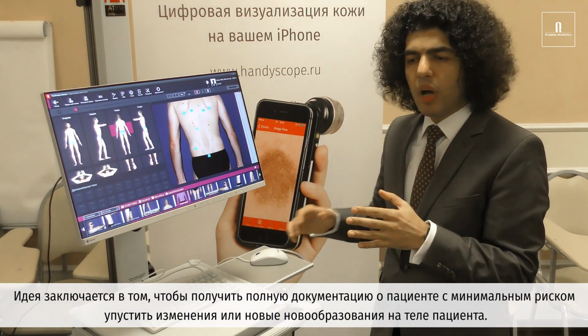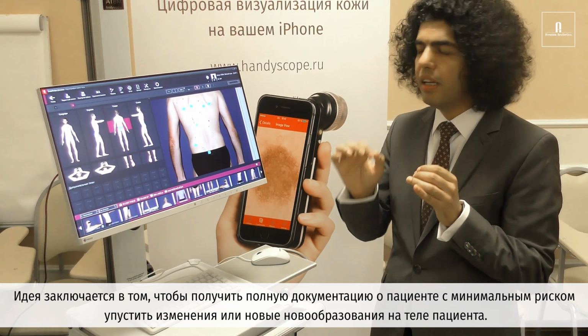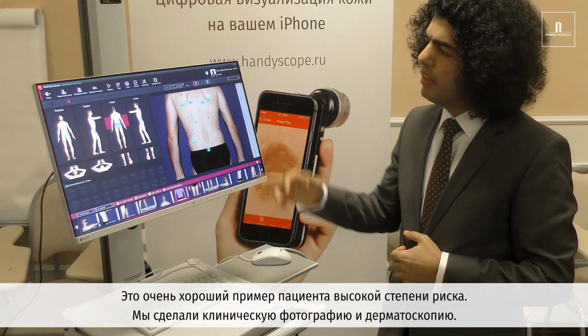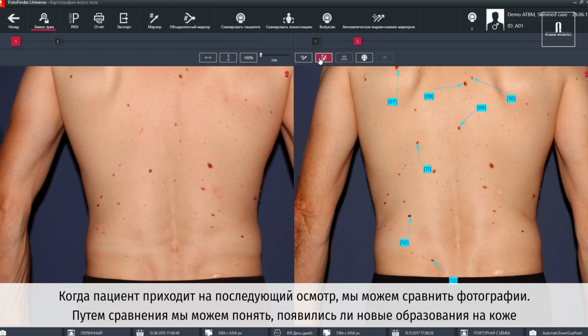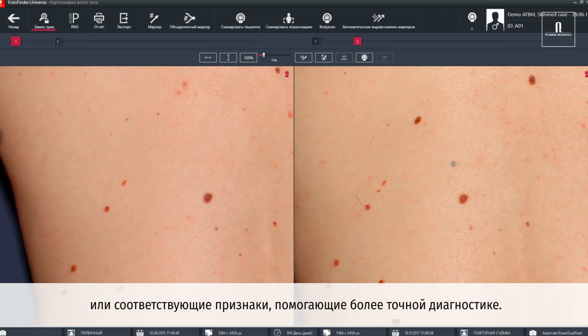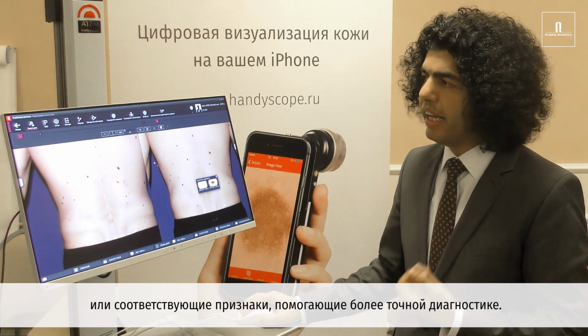The idea is to have a complete documentation of the patient with the lowest risk of missing changes or new lesions on the body surface. In fact, this is a very good example of a high-risk patient. We have done clinical photography, we have done dermoscopy, and now the patient comes back in the follow-up, so we are able to compare the pictures. By comparing, we can realize if there are new details on the skin, new lesions, changes, and relevant points which help us to better diagnose.